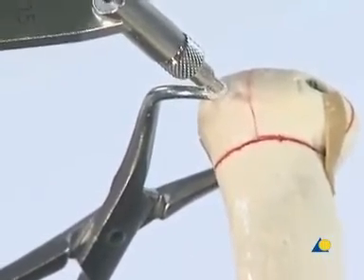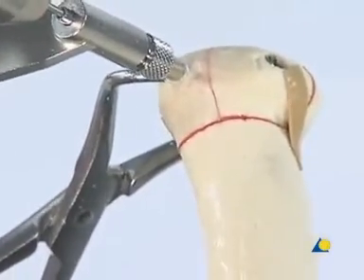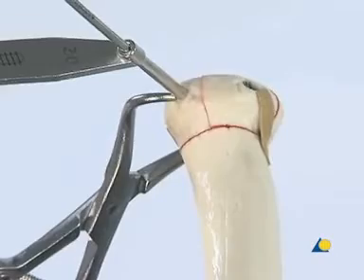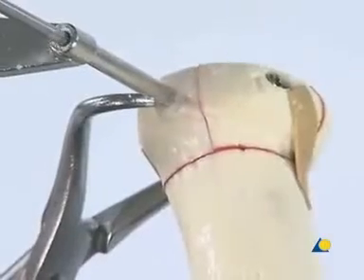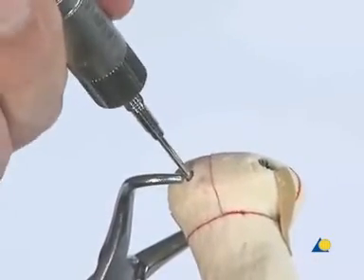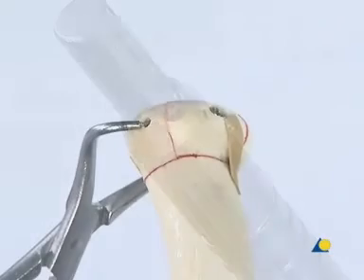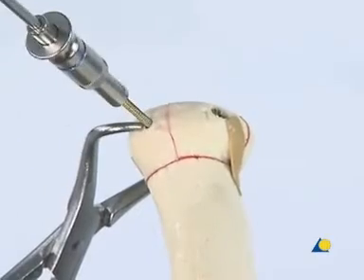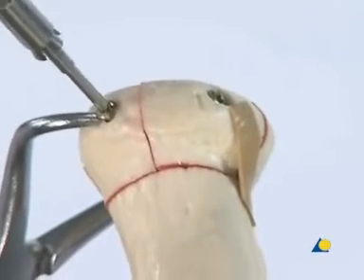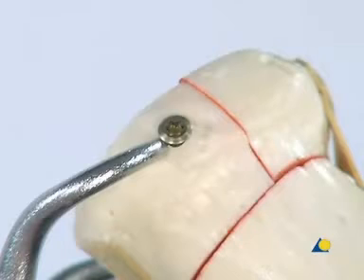The 1.5 mm thread hole is drilled first. The near fragment is over-drilled with the 2 mm drill bit. This screw hole does not need to be countersunk as it is in the neck portion, which is non-articular. The depth is measured and reads 26 mm; a 22 mm screw is sufficient. The screw is inserted and, as it is tightened, it compresses the third fragment against the others. This screw is in the non-articular portion, so it should not interfere with the annular ligament or the proximal radial ulnar joint.